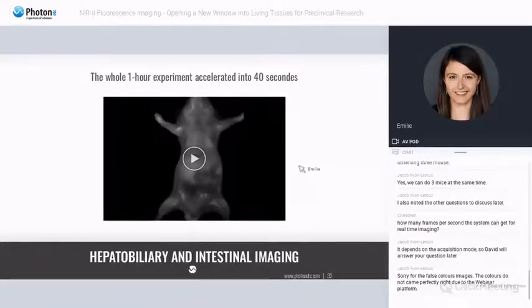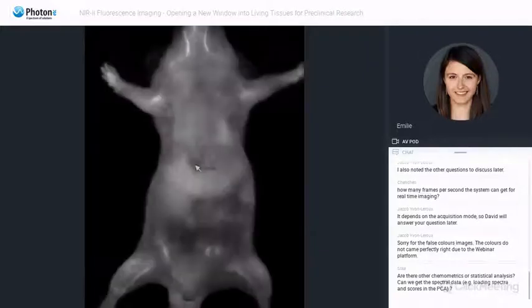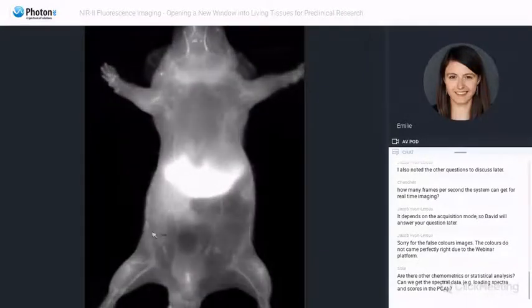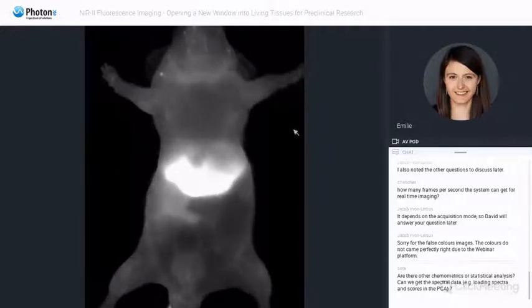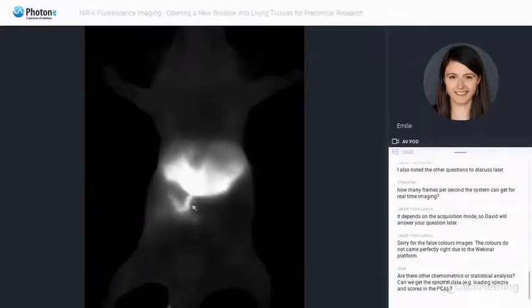Okay, so now another interesting part. As I told you, we just presented the first few minutes of the injection and the acquisition. Of course, 1 hour is too long, but we have prepared for you a super accelerated version of the whole video. So let me just go select it, and we can look at that together. So if I start it. Of course, really fast, we have the signal coming in, and then you see that the signal fades out around the mouse and accumulates in the liver. And then after some time, about half an hour, we can see that the liver starts to excrete the signal. And we can even see a bit of the peristaltic movement inside the intestine.